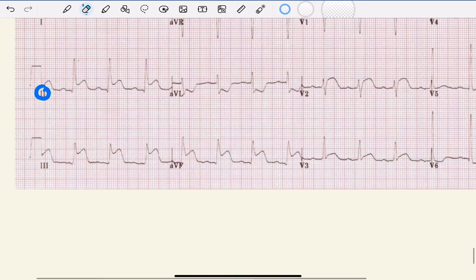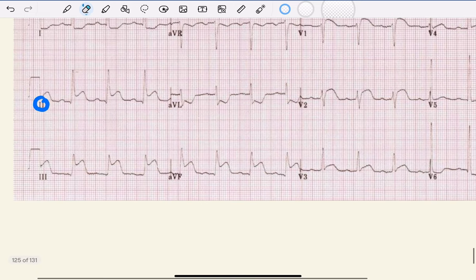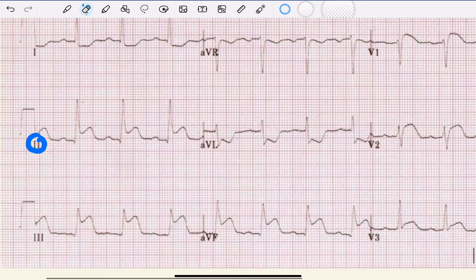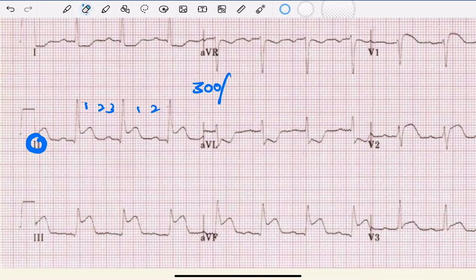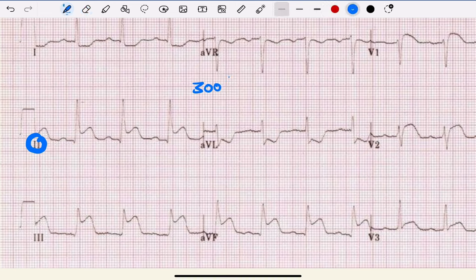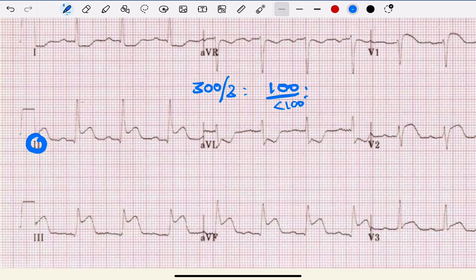Next we calculate the rate. Rate is calculated by 300 divided by the number of big boxes between RR intervals. It's slightly more than three boxes, so it's around 100, borderline. If you calculate very appropriately, it comes around less than 100. So the rate is normal.